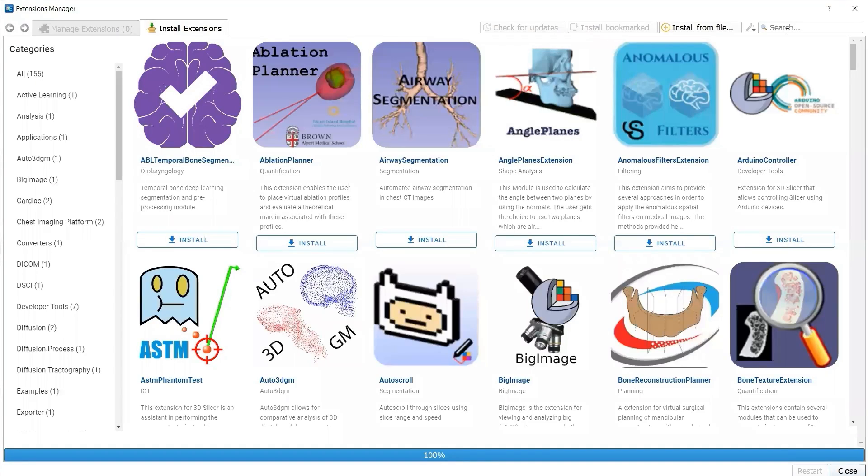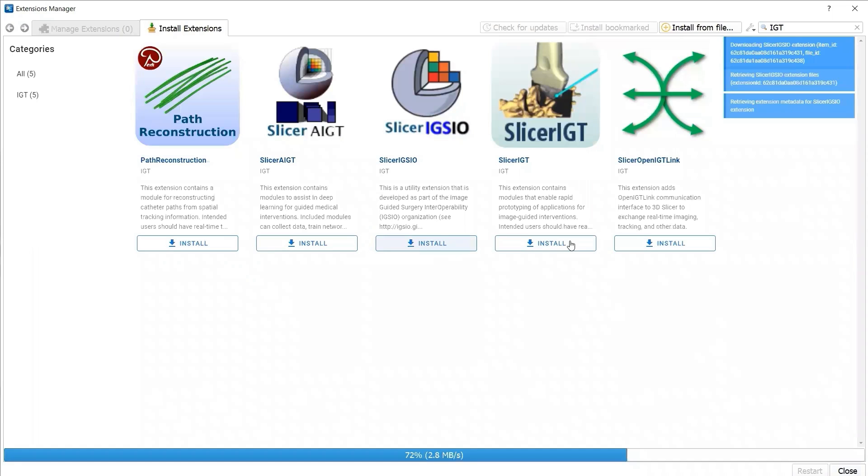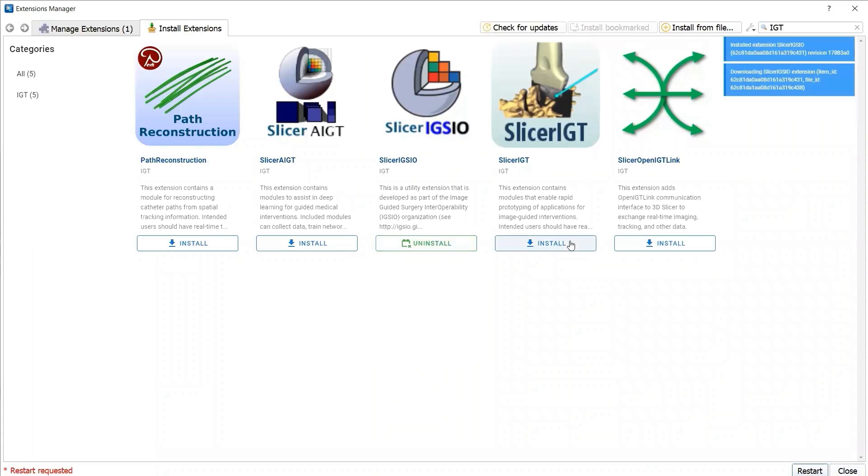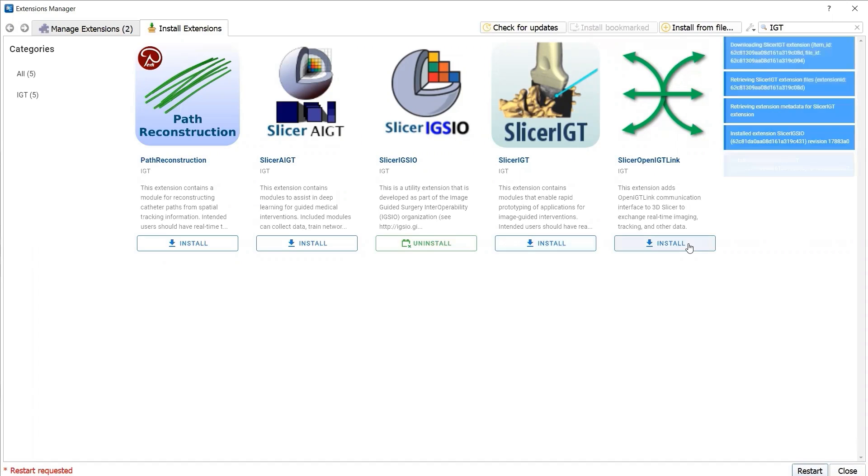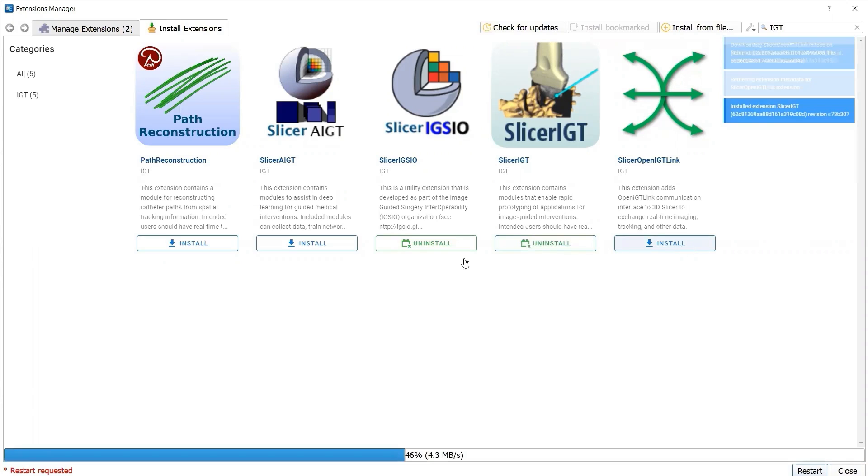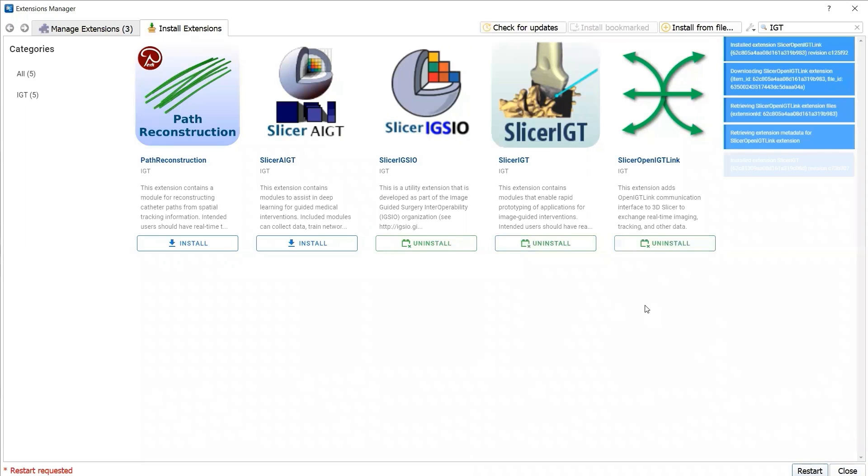Search for IGT and install SlicerIGSIO, SlicerIGT, and SlicerOpenIGTLink.